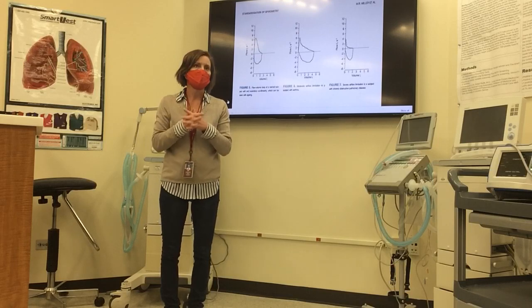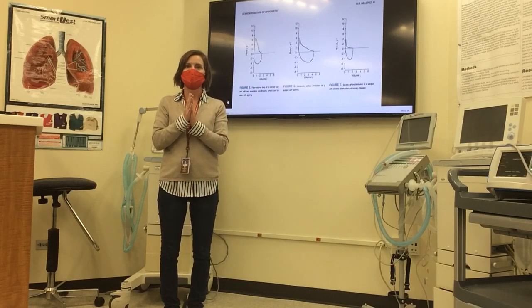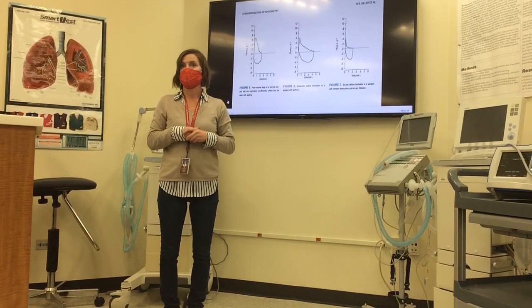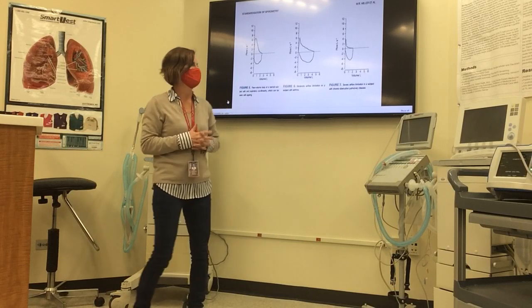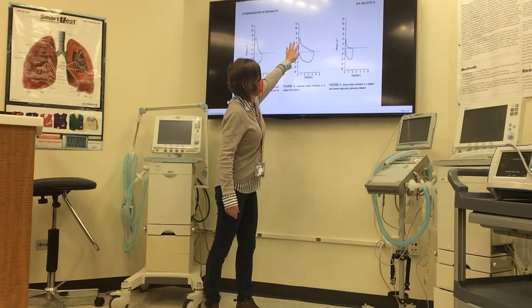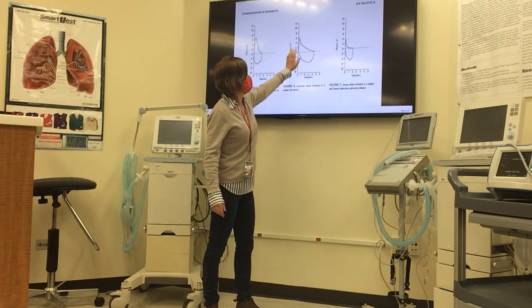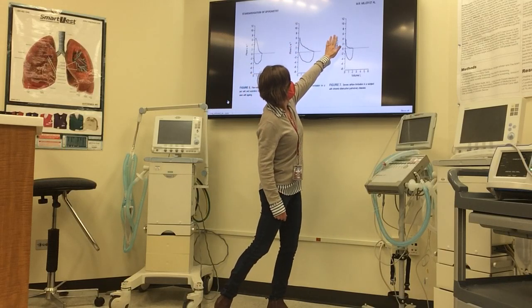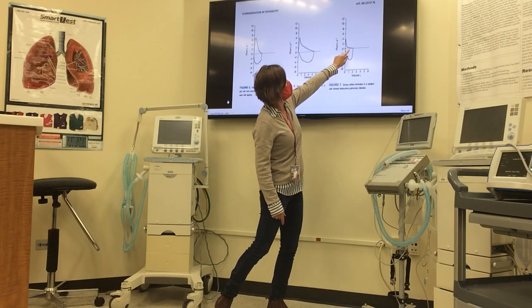That's why it's really important for us to all stay cardiovascularly active so that we can work on decreasing that faster aging process. This one would show moderate airflow limitation with a subject with asthma. And this one, what do you think? This would be severe airflow limitation.